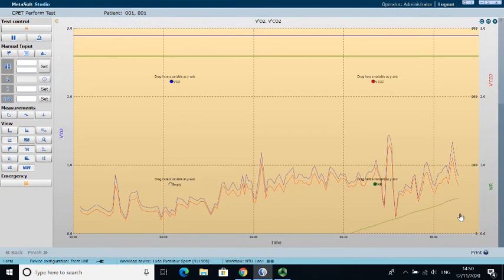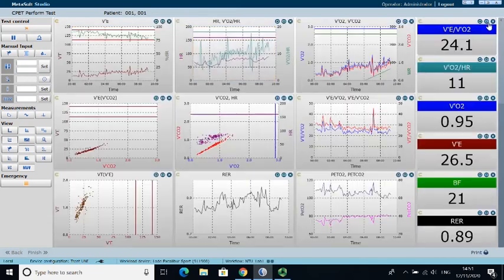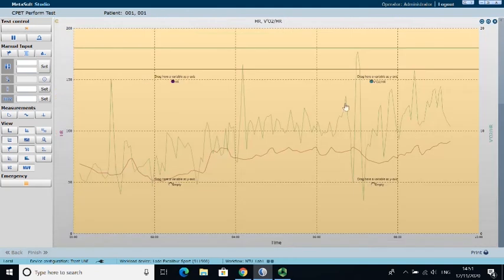Okay, so we can start to see this idea of a linear relationship. If we look at the green line, which is work rate, we can see that slope slowly increasing, and then we can see oxygen consumption in the blue increasing in a similar way, and also, as I said before, CO2 slightly offset, so slightly lower, but matching that same profile. And this is what I was really talking a lot about in the lab, to get this concept through to you, that certainly in moderate intensity exercise, this relationship holds fast. If you follow it through and think about it logically, what's happening here is we need to produce more work in order to move these pedals around.